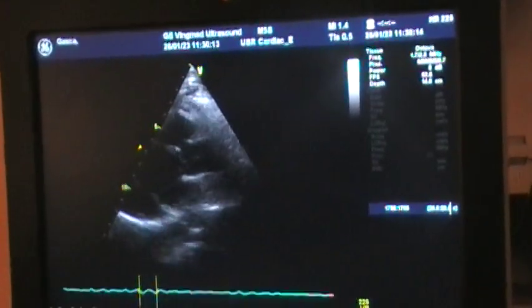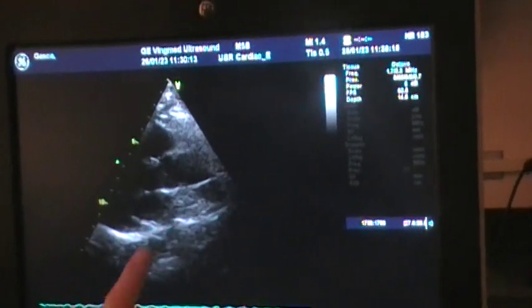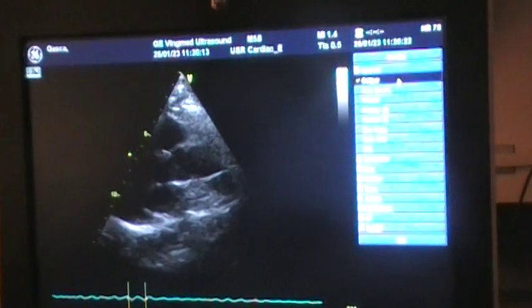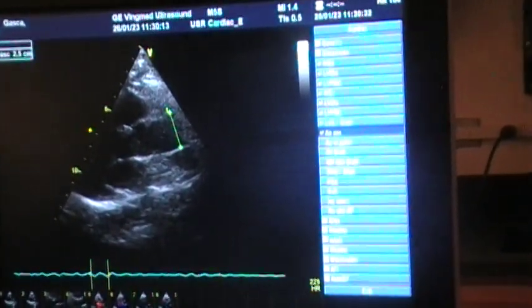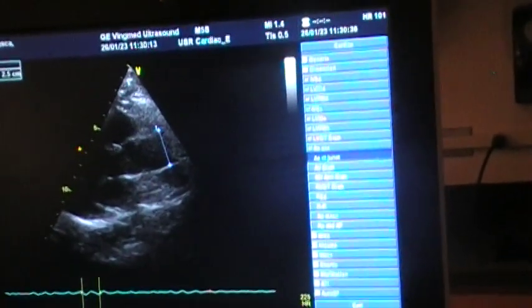And the reason you want to do this is anytime there's aortic stenosis or a bicuspid aortic valve, they're more likely to have a dilation of that ascending aorta there. So I'm just going to remeasure that ascending aorta since I can see it farther up. Now, you know the abdominal aorta can only be 3, the thoracic can be up to 4 before they consider it aneurysmal.